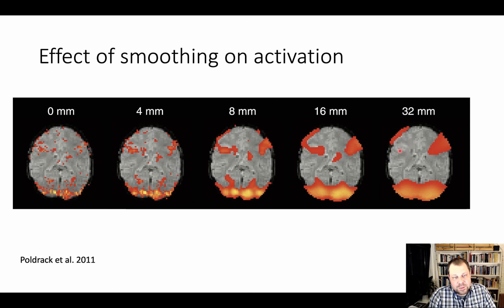So that's what we mean by if the activation size does not fit the filter, then you're actually losing signal, such as in the left hemisphere here. So this signal here, that's quite large and quite significant, actually disappears here. So this is not a filter that supports this type of signal. And that's a trade-off that we have to live with, especially when we talk about cortical versus subcortical activations, because they're relatively large in cortex, most activations, but they're relatively small because the regions are also small, such as in ventral striatum in subcortex.